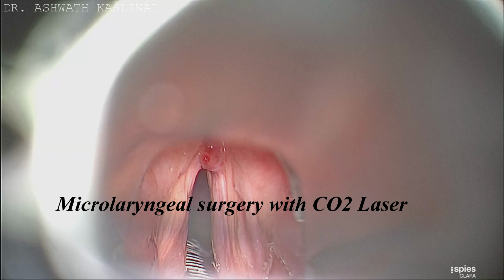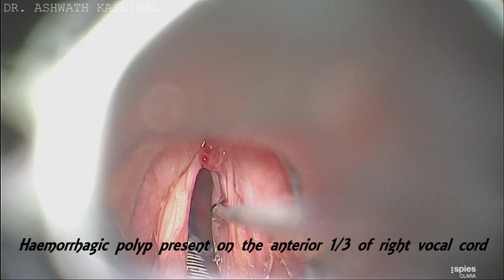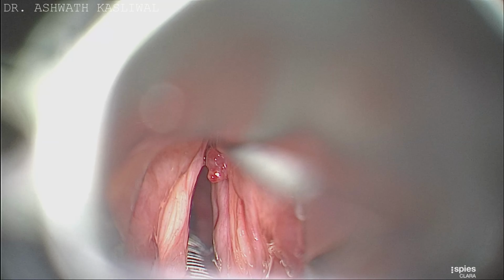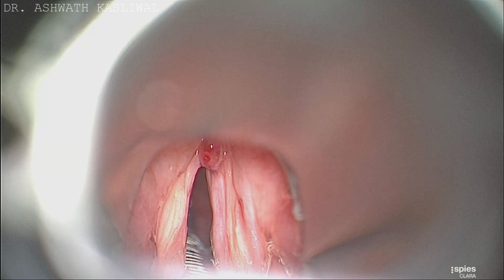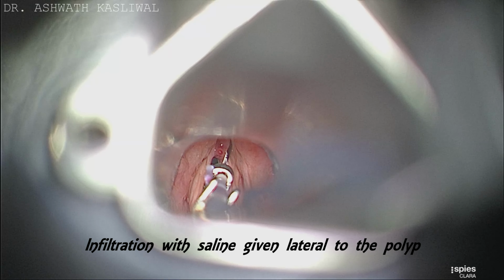Today we have a case of hemorrhagic polyp present on the anterior one-third of the right vocal cord. This is a teaching video for surgical removal of a polyp with a CO2 laser. We are operating this case with the KLS Martin CO2 laser.